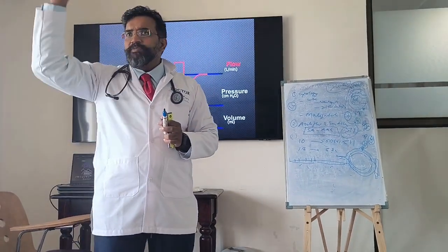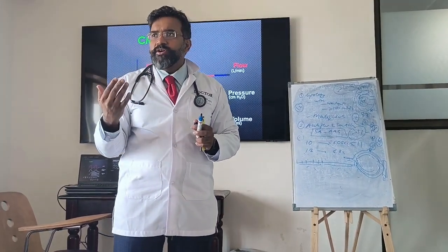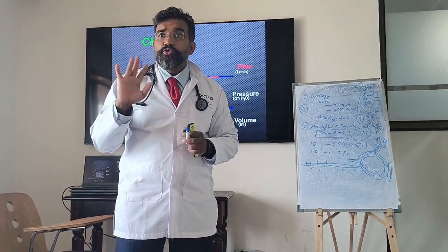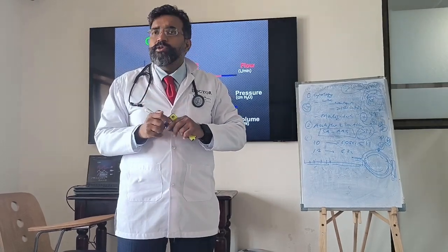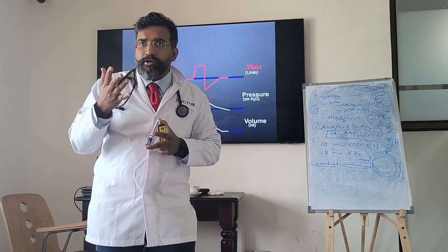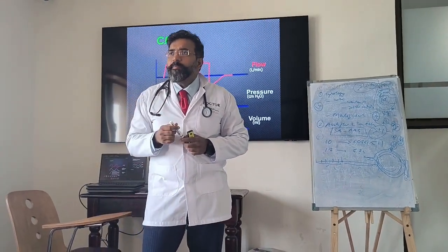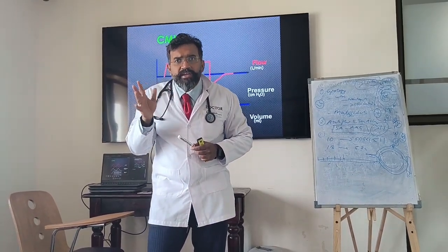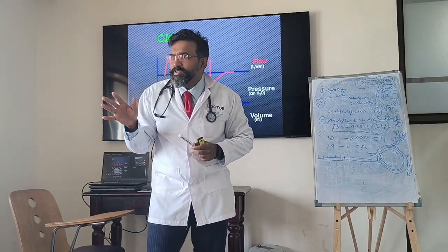So if you set +5, that means the patient has to have a large amount of flow change to initiate the breath. So how much should be set? Okay, you're asking how much trigger to set. It depends on how your graphics are. If the patient is a strong patient, on an average -3 is fine, on an average +3 is fine.